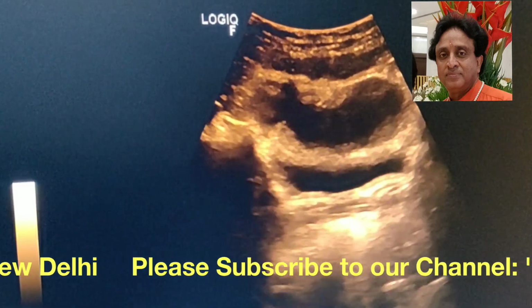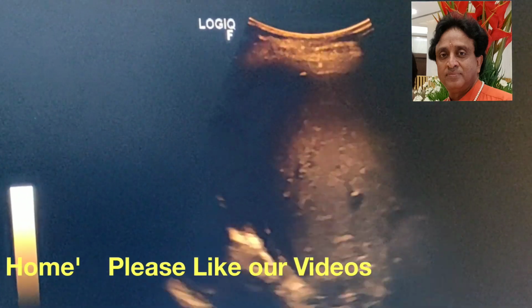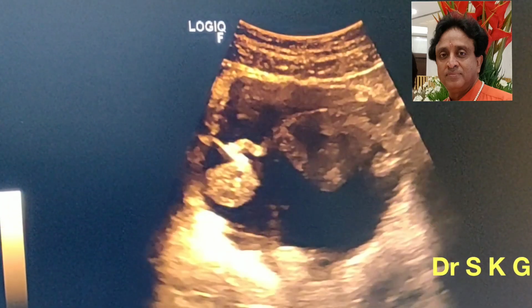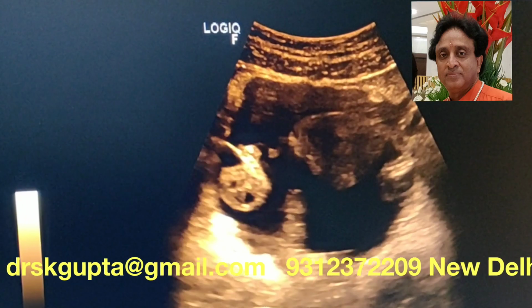You can see that the organs of the abdomen are floating in the free fluid, and this is the uterus, and this is the ovary, and they are floating in the abdominal free fluid.